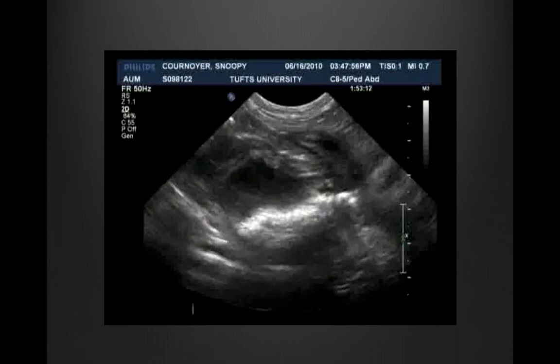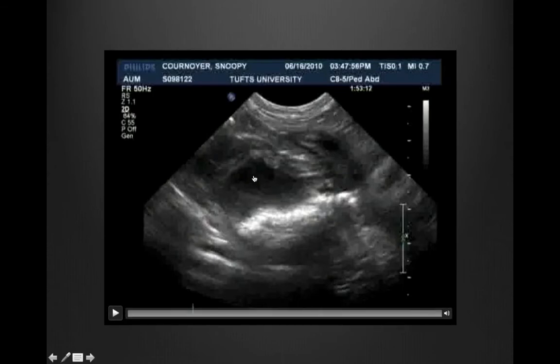This is a relatively brief video. When it starts, we're going to be looking at the urinary bladder — we've got the lumen of the bladder and dependent hyperechoic mineralized debris in the bladder. Then we'll move caudally and we'll see the prostate as well.